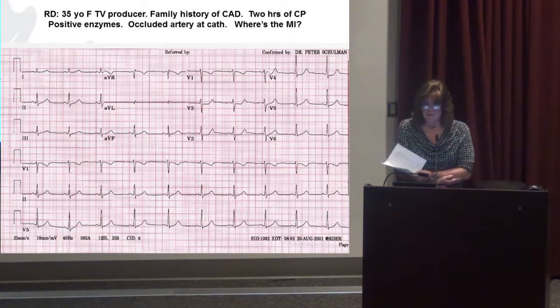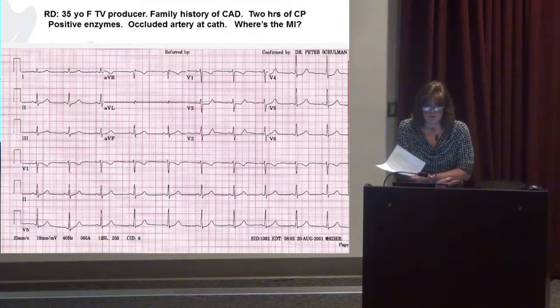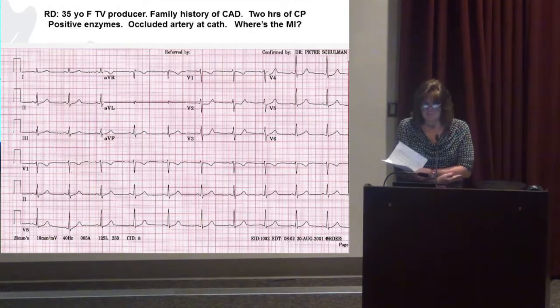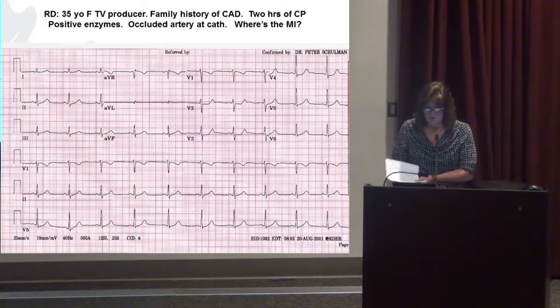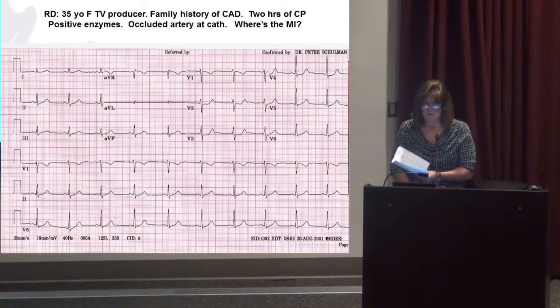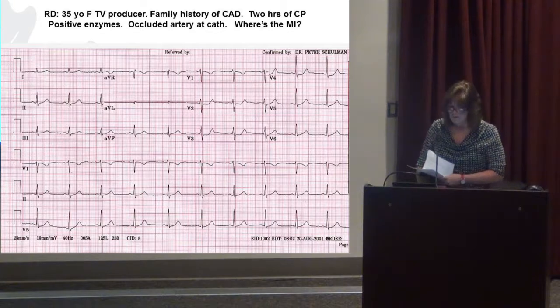Posterior MIs are rare, right? That you would only damage the posterior part of the heart. Usually those are associated with a lateral or maybe an inferior posterior, but to have a straight posterior MI is unusual. Like only maybe 3% of MIs are straight posterior. But that's what this lady had. Very atypical, right? Very unusual. Okay, but she did have an MI, and she ruled in with enzymes. Something went on there, and she'll need to have an echo and further testing to see how much damage there is to the posterior wall. Hard to see on a 12 lead, but it'll give you a clue when you see that ST depression over the anterior septal leads.